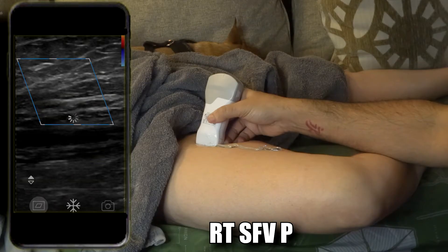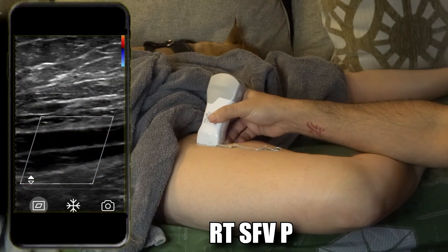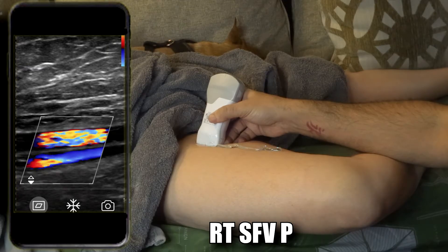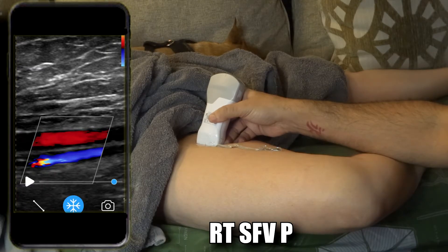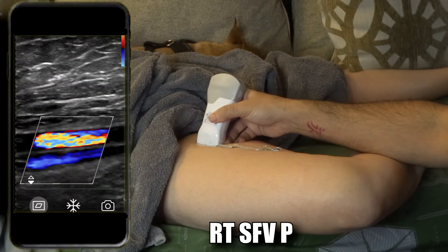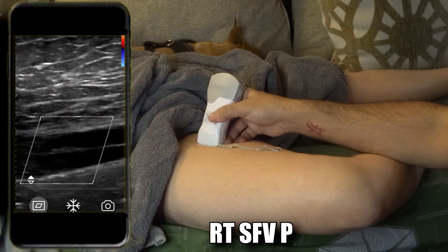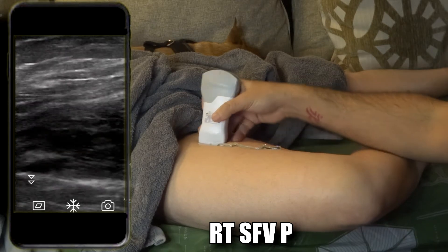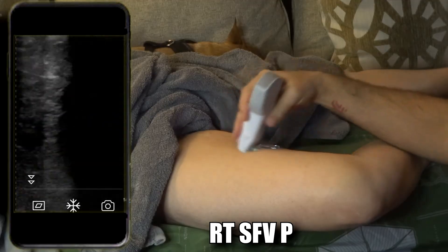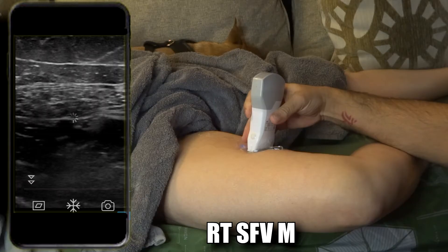Put the color Doppler on and here you can see — I'm able to steer now, I figured it out, it's just that bar in the middle. You can see arterial flow there, very nice. I'm using the second setting which lowers the PRF, because it does increase the amount of aliasing. Take that picture. Do an augmentation — take it off. You can go further down to the mid superficial femoral vein.